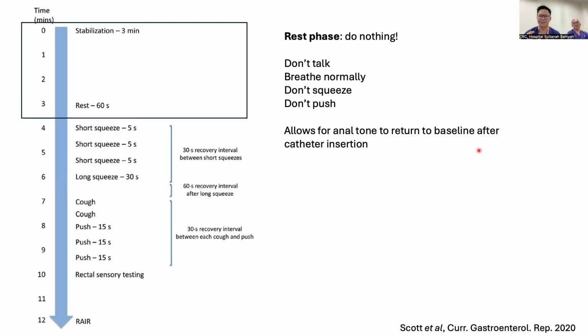And the simple short segments start with a resting phase. You tell the patient, just lie down. You insert it inside. You lie down. Don't do anything. Don't talk. You can play with your phone. Don't cough. Don't sneeze. Do nothing.